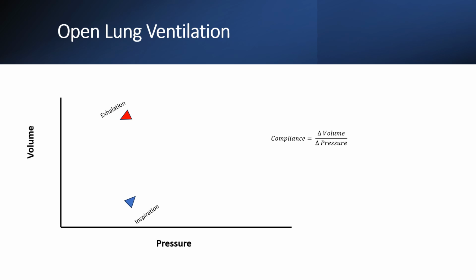Jet ventilation can be described as an open lung technique of ventilation, as it aims to maintain an adequate mean airway pressure that allows the alveoli to maximally participate in gas exchange while preventing collapse and overdistension and the resulting alveoli damage. The pressure-volume loop can be used to represent this idea. In a normal lung, as pressure is applied to the lung, the alveoli will inflate and fill with a volume of gas.